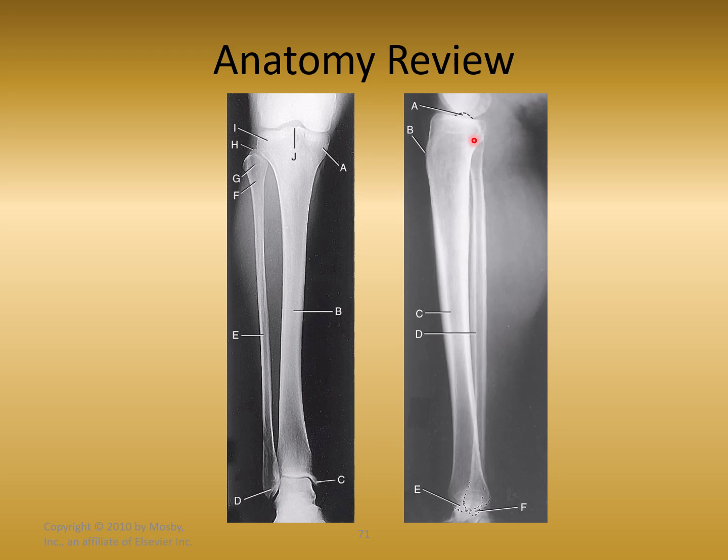Criteria for no rotation: the posterior half of the tibia superimposed by the fibula. That tells us that it's in a true lateral with no rotation. Now, to describe that we place the leg parallel to the IR, we would say that the long bones, the tib fib, are shown without foreshortening.